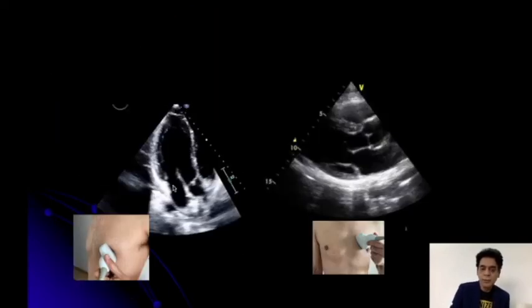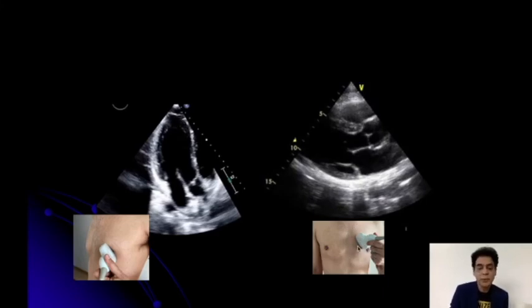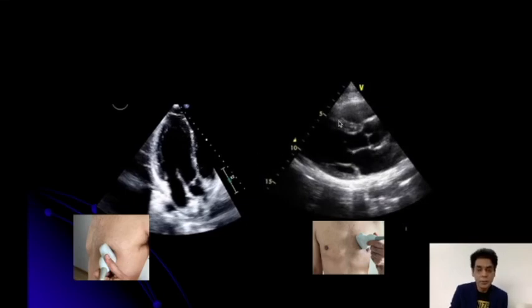You can see these two pictures — both are long axis views of the heart. The difference is this picture is taken from lower down, somewhere around the nipple. So this picture will have the apex, because the apex is somewhere here, and the apex is seen quite clearly. While this other picture, the probe is angulated towards nearly the same region on the right side, but it is placed higher up close to the sternum. So this is the parasternal long axis view, and in the parasternal, you can see the orientation is different — you do not see the apex, and the septum which was more or less vertical here is now horizontal.